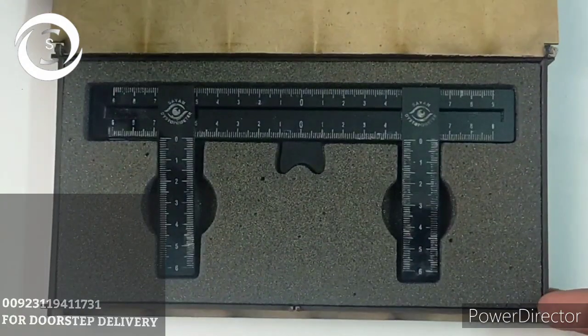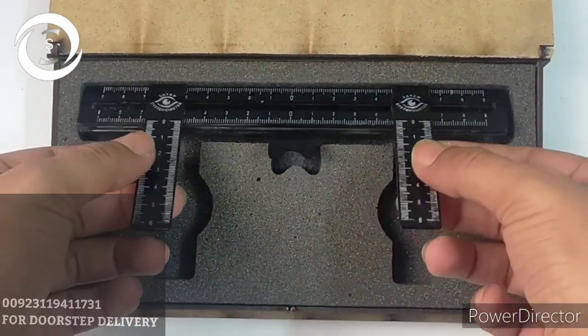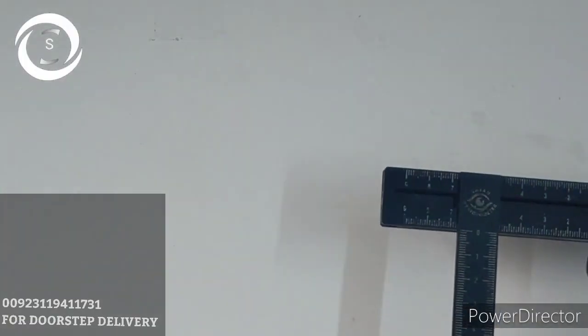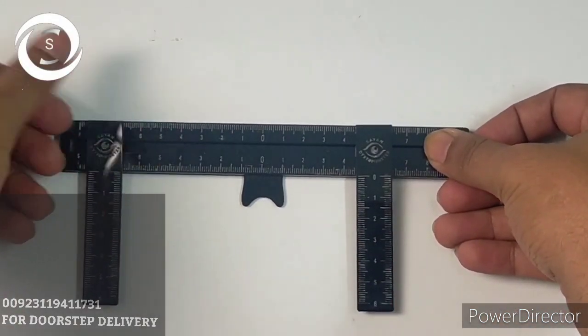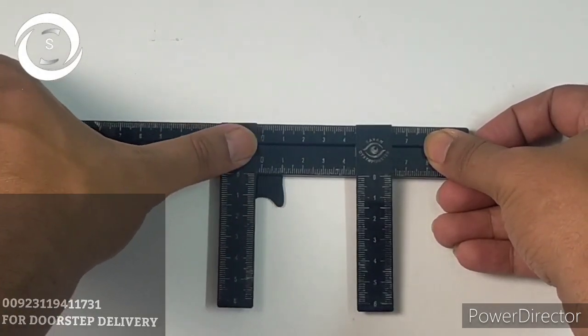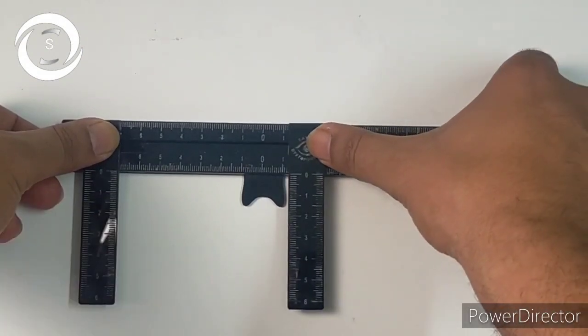Today in this second video of Sayan dystopometer, I would like to give you a practical demonstration on a patient of how to use it. First, bring it out of the box and check whether both vertical arms of the dystopometer are moving freely or not. If they are moving freely, it means it is ready to use.